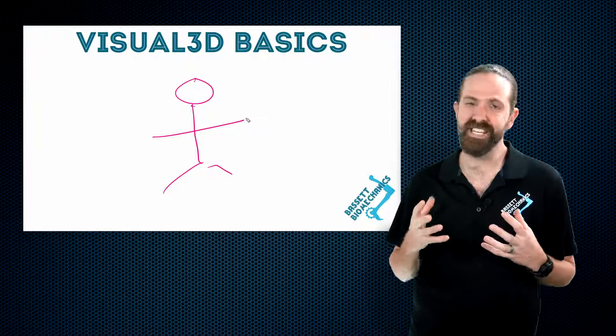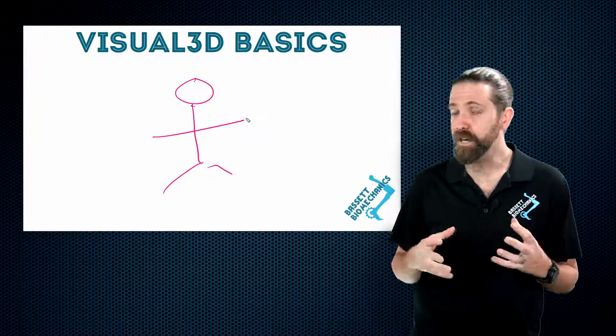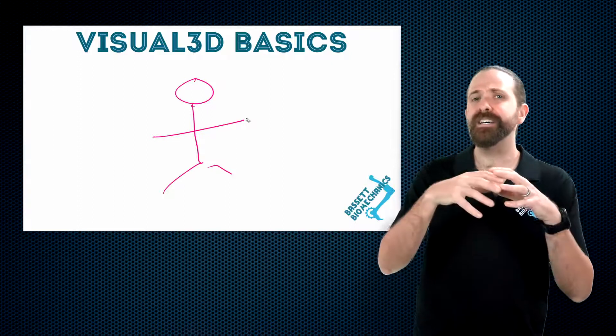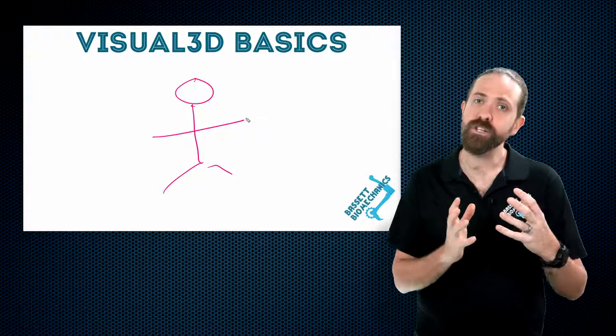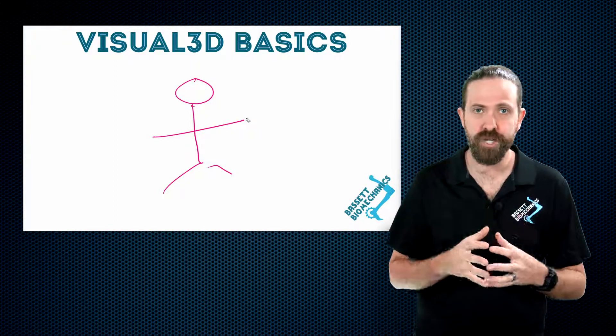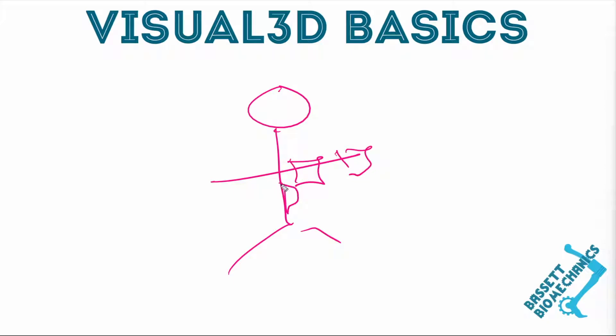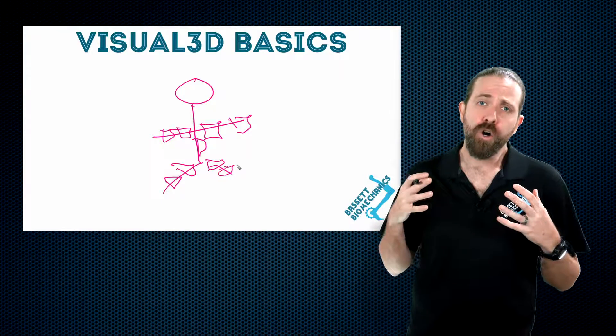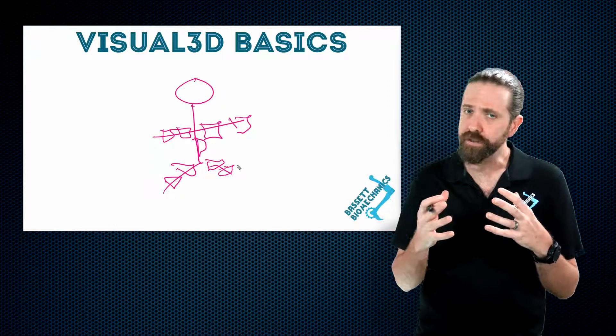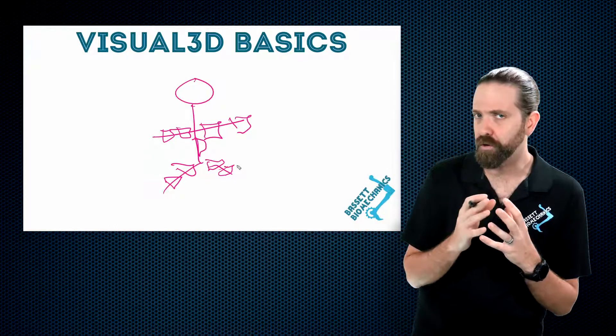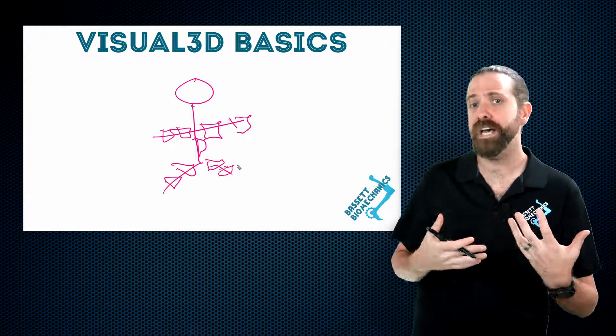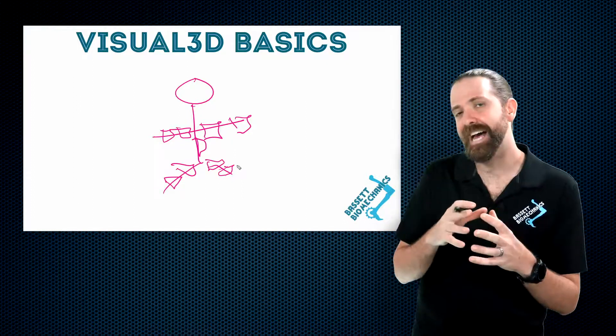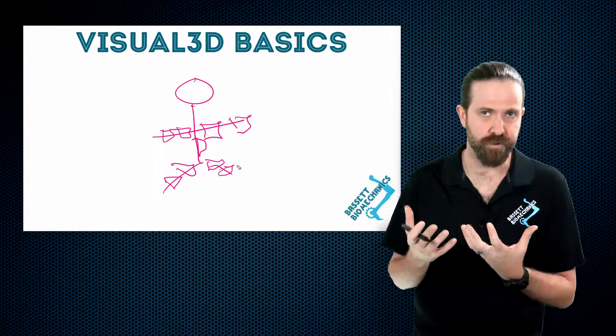This model is generated in different ways depending on how you collected the data. But no matter what, you have a model in Visual 3D and you have motion files associated with that model. That model will include individual segments. These segments are going to be related to each other based on that biomechanical model, which allows us to calculate things like joint angles and joint moments if that data has force plate data associated with it.